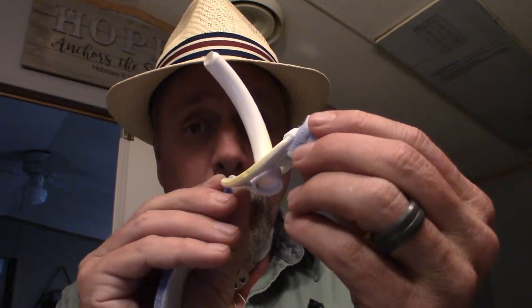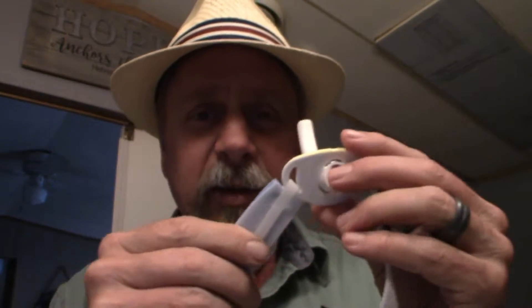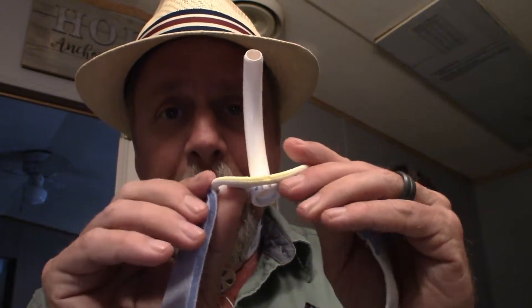The first thing you want to do is get some things prepared in advance. We're going to be changing this trach, so you want to get your new trach cleaned and prepared and make sure that it's sanitary. I've gone ahead and got my new trach that we're going to put in, and I went ahead and put the new straps on it. I have found that it's easier to have the straps on and then put the trach in, as opposed to putting the trach in and then trying to do the straps. So that's just a little shortcut.